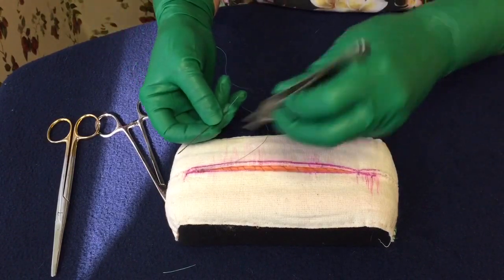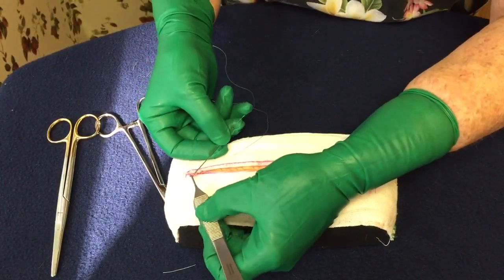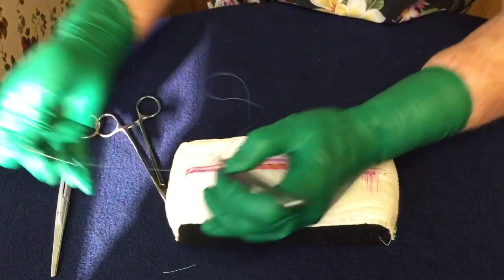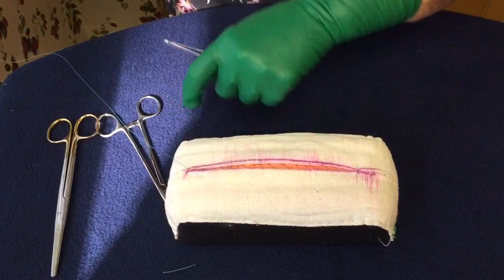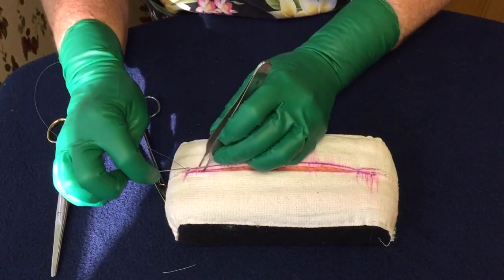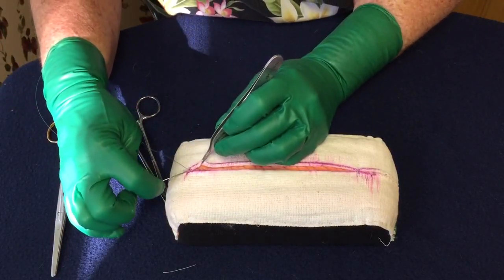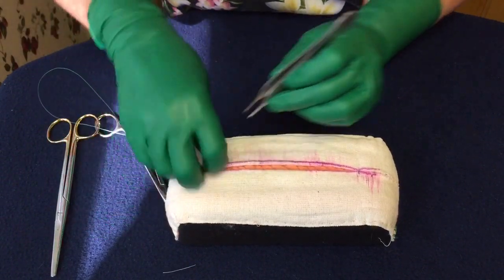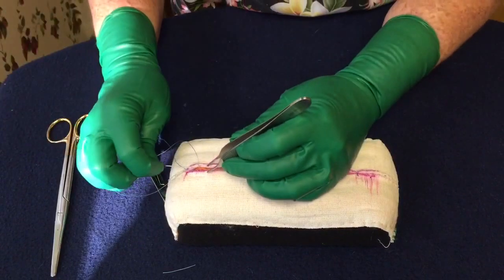Bury the knot — which is already partially buried. Now you can go back to your corner and begin your running subcuticular, so now that knot is buried underneath. When you start your running subcuticular, I'm going to go all the way to the other end, but because I don't want this video to be too long I'm going to make the stitches bigger than they should be.